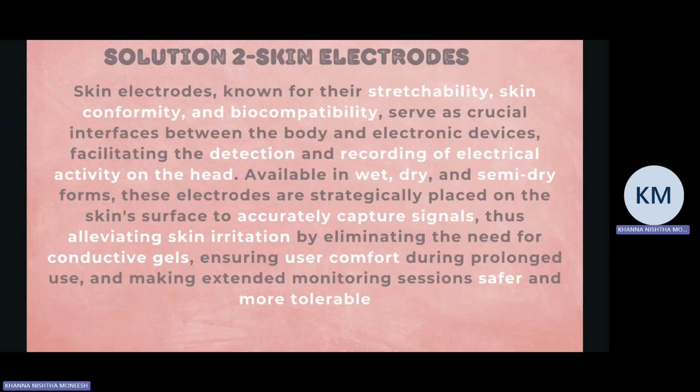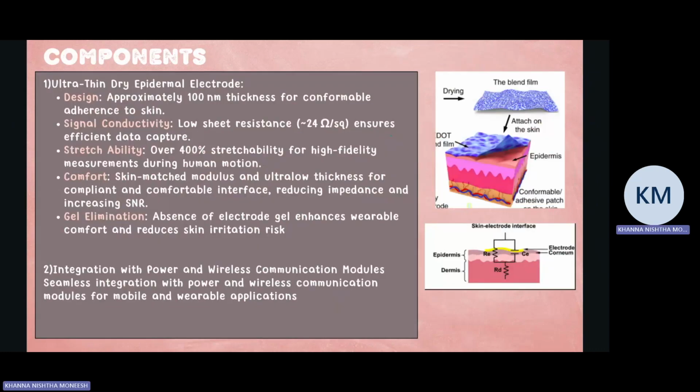These electrodes are strategically placed on the skin surface to accurately capture signals, hence alleviating skin irritation by eliminating the need for conductive gels, ensuring user comfort, and making monitoring sessions safer and more tolerable. These are the components of the skin electrode.